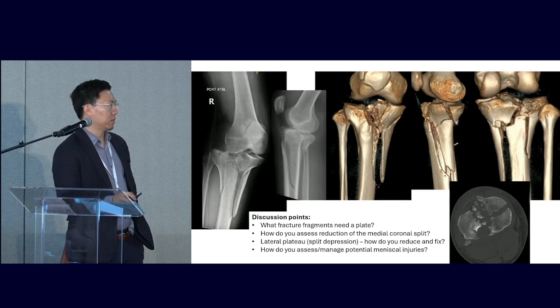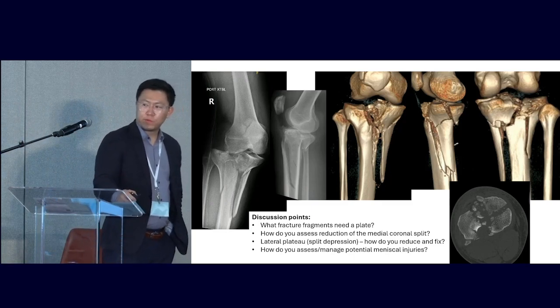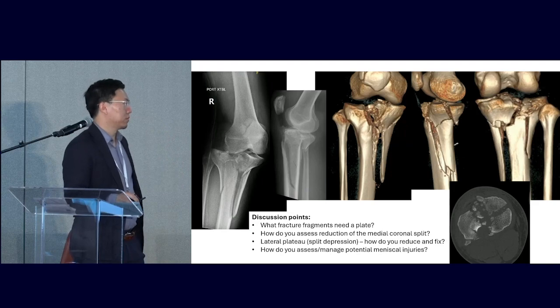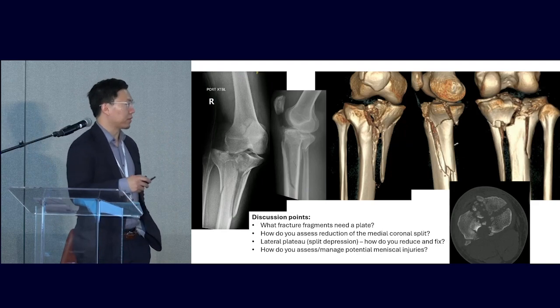And how are you going to hold that? A little tiny T-plate or something like that? Yeah, a posterior medial plate. So now you've got the medial side. And then lateral, what do you got for lateral? You're going to make two incisions.